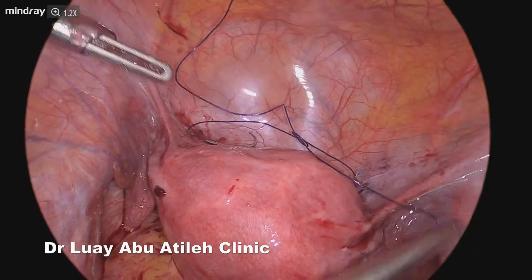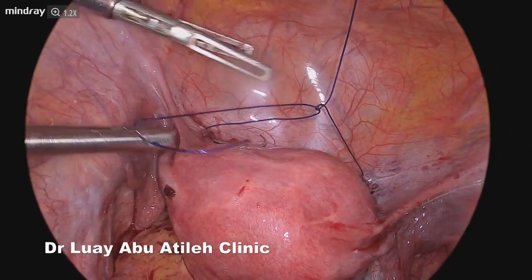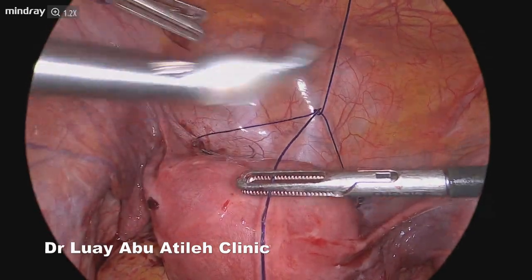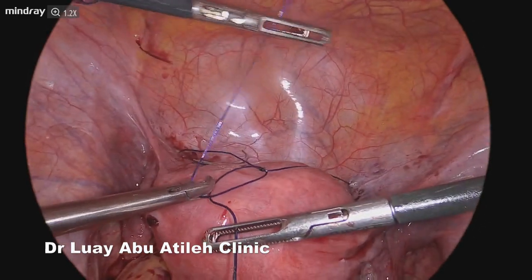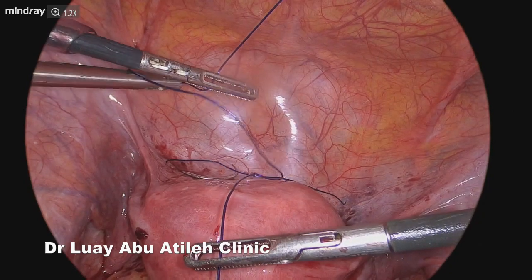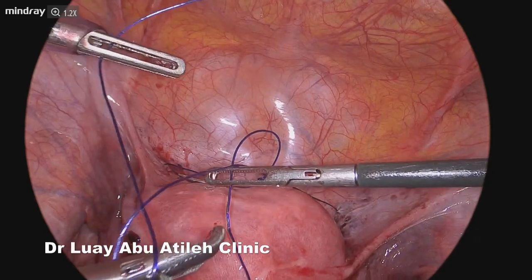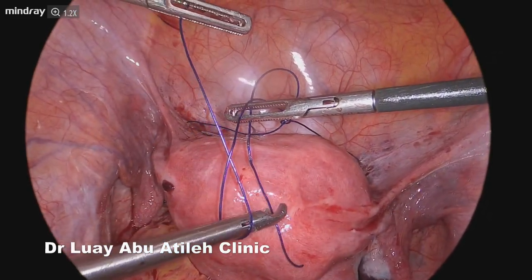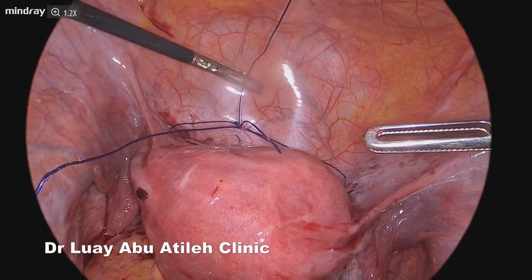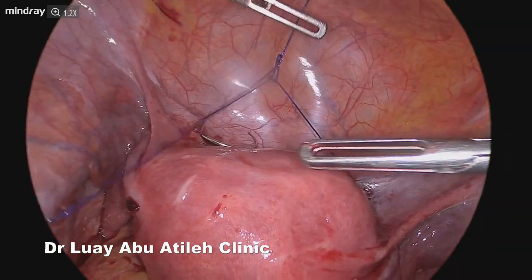We perform the hangzman tourniquet technique by doing a sliding knot — one loop clockwise and the other counter-clockwise — without needing to tie it completely. Then all you need is to invert the knot by pulling the extracorporeal string upward, and the shorter string on the right side inferiorly, which is the string you are going to slide over.